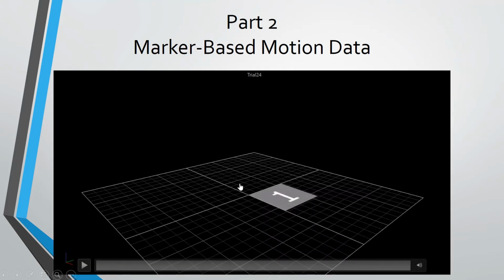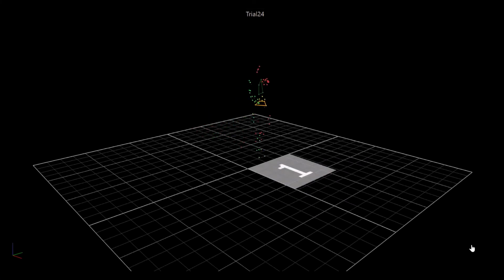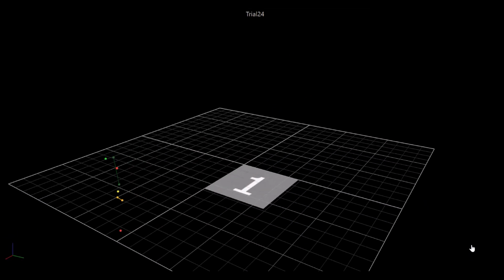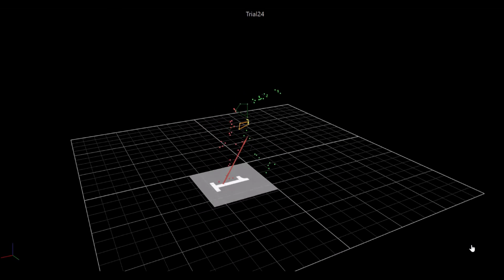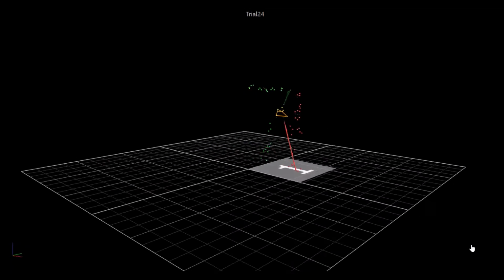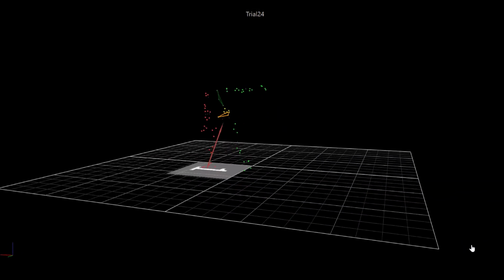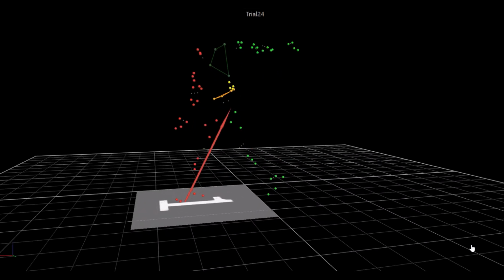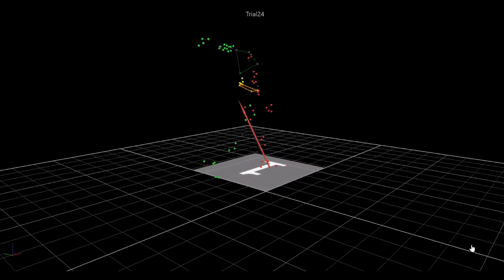So here is our marker data of the cricket bowler from before. We'd labelled them previously. Now we've modelled our data, and you can see some joint centres there. We might just have to wait until we zoom in a bit on the data to see them a bit better. And we can now export that data, and we have our readings for each of the joint angles throughout this entire movement. There we go, you can see some elbow, hip, knee joint centres there.